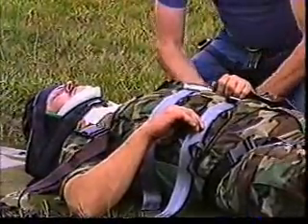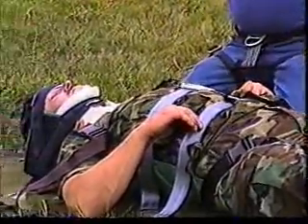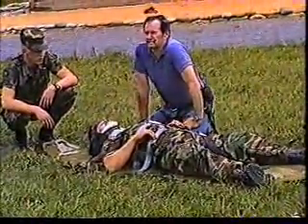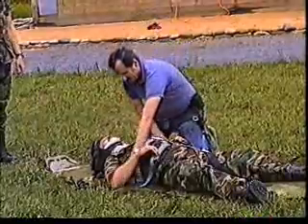Okay, once we get that snug, the shoulders are retracted and now the clavicle fracture problem has been addressed. If you're concerned that these might come loose, because if you have a real thin patient, you can take these straps and tie them together. That'll hold them in place.